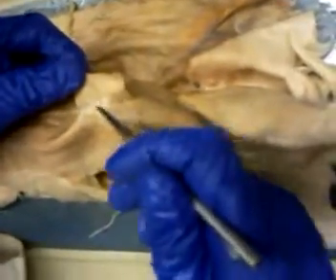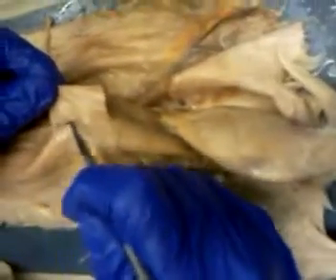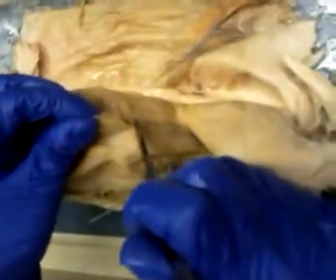So, I'm just finding connective tissue fibers and breaking them and peeling this layer up. And then when I get to the point at which I haven't cut anymore, I'll just take my scalpel and help it along.